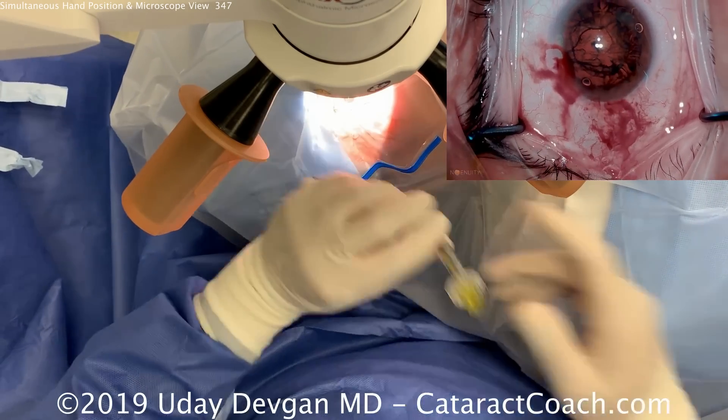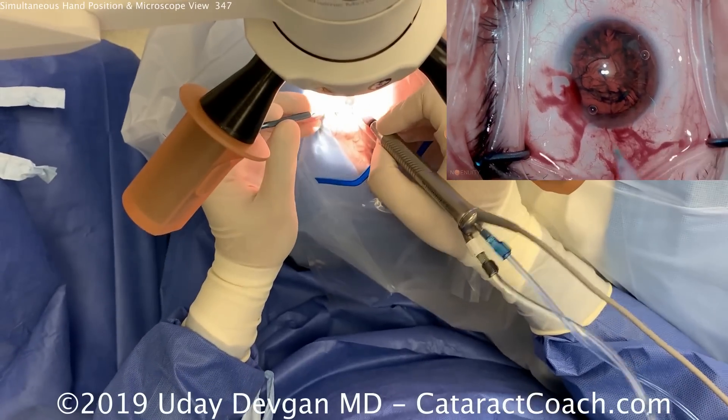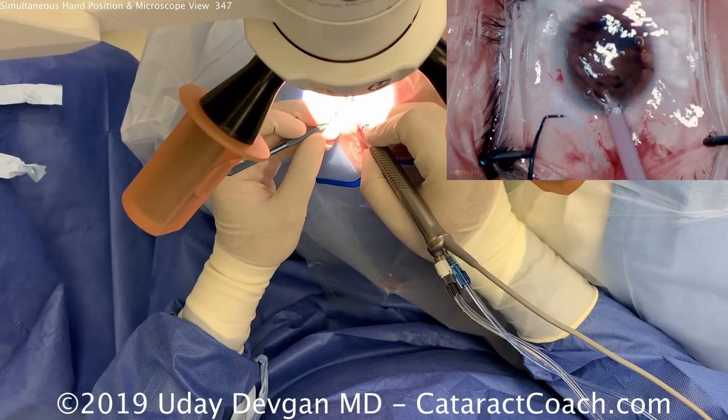Now that we have a rotating nucleus, a little more dispersive viscoelastic going in the eye. Now we're ready for our phaco probe and our chopper, and we're going to use a chop technique here.